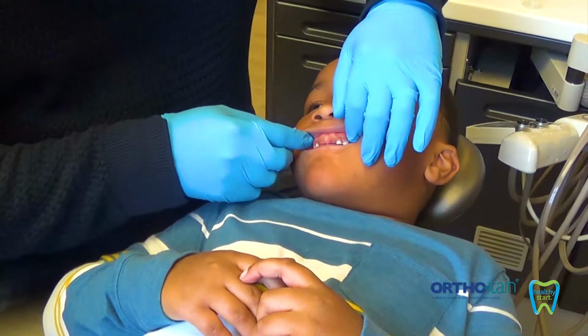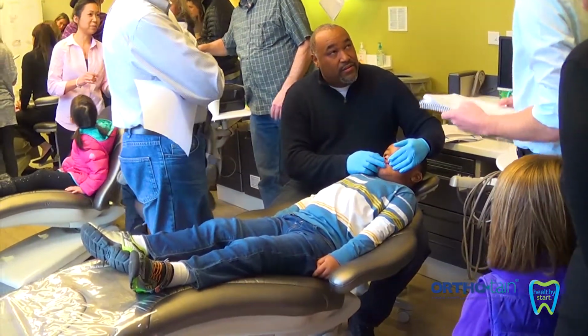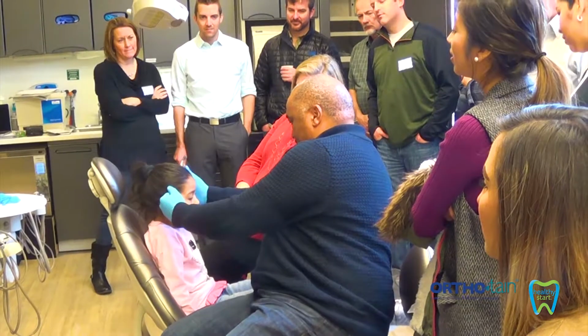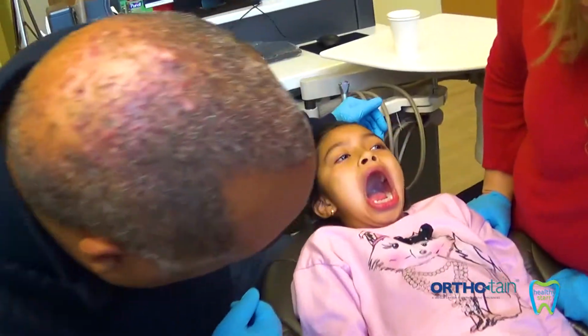For me to introduce a product, I usually tell parents this is what I've done on my own child. Mind your back teeth again? It's very important for me to practice what I preach, and so I think we can get him started now, which will help. Dr. Lee, maybe. There we go. And close. Upper posterior archway. Can you open real big for me? Oh, that's kind of big, huh? Stick your tongue out and sing with me.